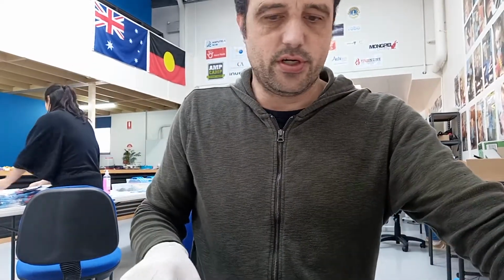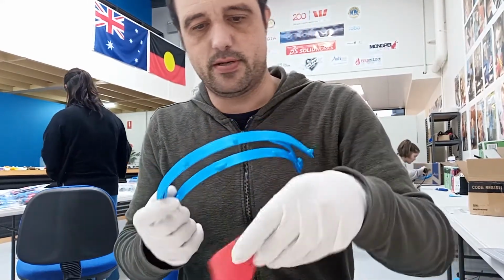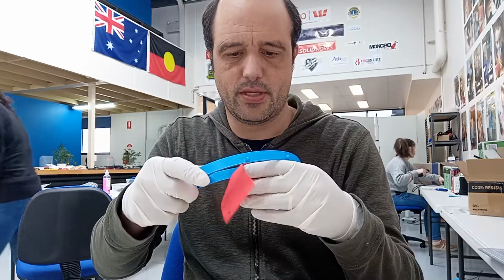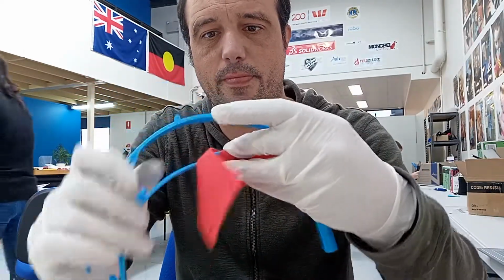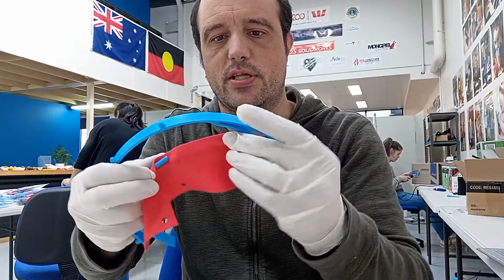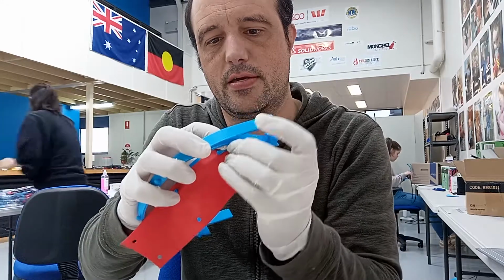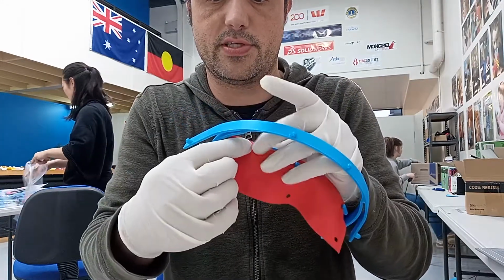So without any further ado, I'd like to assemble this. And I'll show you how I assemble it. It's much easier to put this on first rather than once the shield's assembled. But it just fits over these lugs here. You just put it on, and it should stretch a little bit, the material, to allow you to fit it over. You can see that. So that fits over there. And on the third point, so there's 3 mounting points.